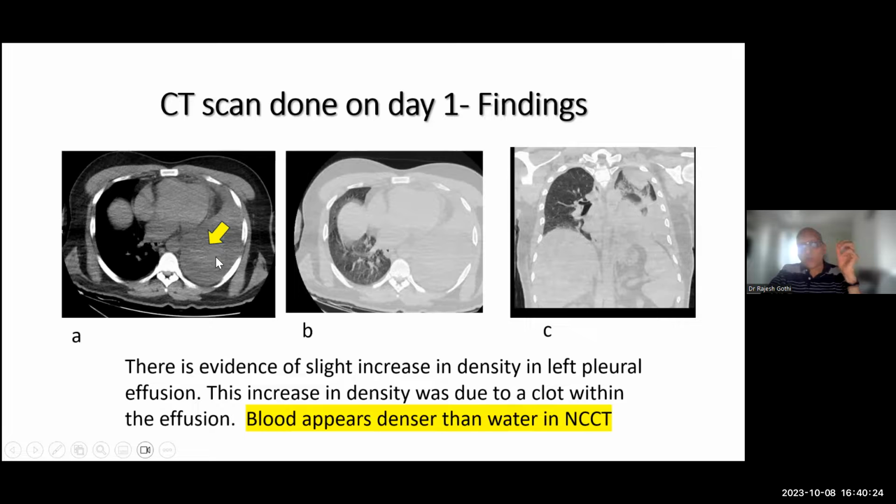In fact, what I always do when I'm doing the CT scans, or when I'm supervising the scans, is I always do an NCCT. So I sit in the CT room, I see the CT scans, I do an NCCT, and if I find that the CECT is not going to be of any worth, I don't do it. But if I find that it will be needed, I go ahead and do it without having to ask the patient or anybody whether contrast is needed or not.